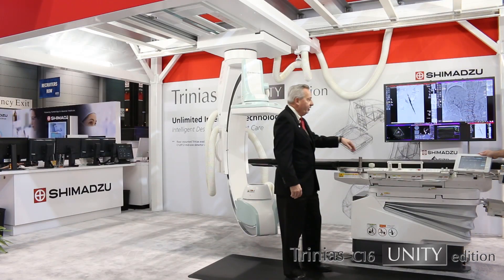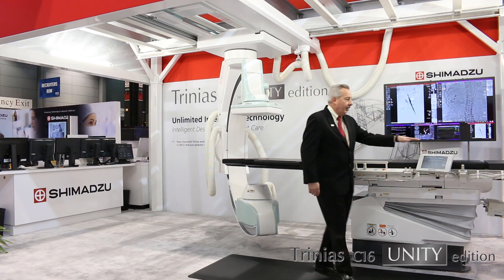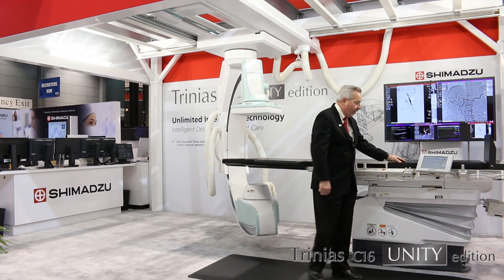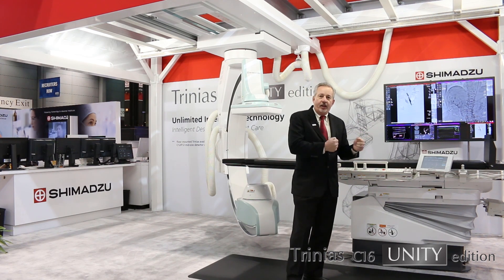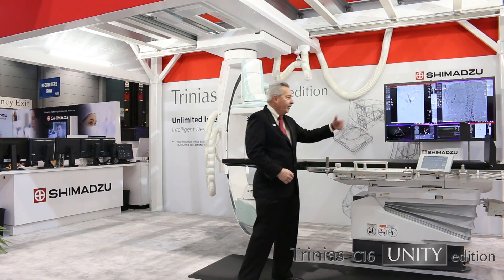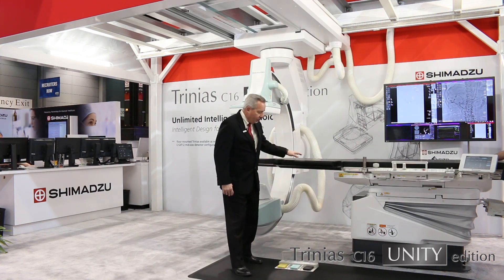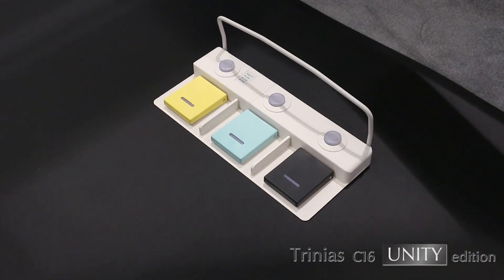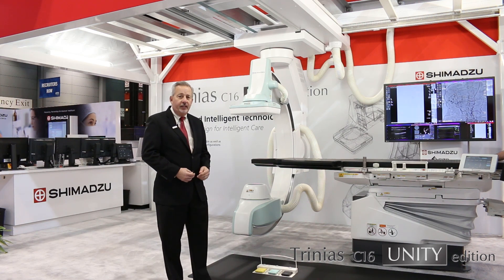One of the unique things about our KS100 table is the cable management system, which keeps the cables up off the floor. By keeping the cables off the floor when you're moving the table around, you have the advantage of not pulling the cables out and ripping them. The controls can be moved from side to side and the cables just lay in the end of the table. One of the features we offer to many customers is the wireless foot switch. It has six programmable buttons, so you can customize it to your own specific needs.